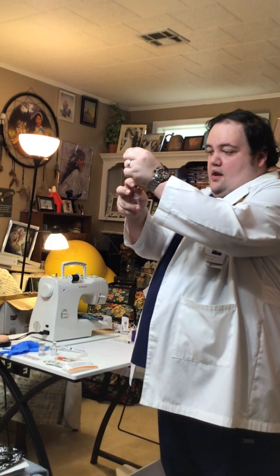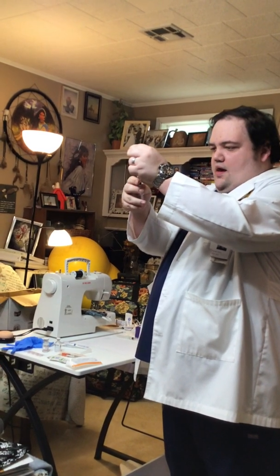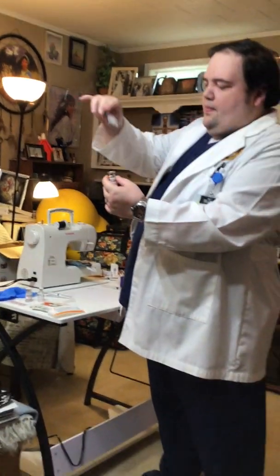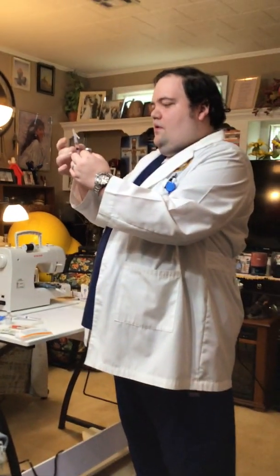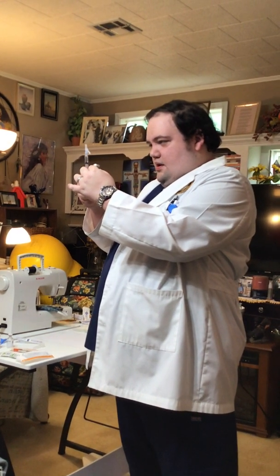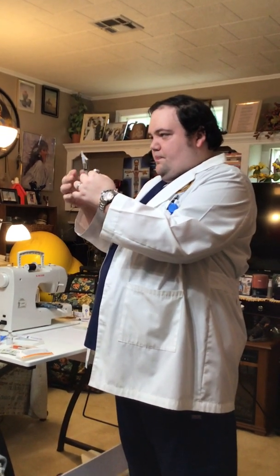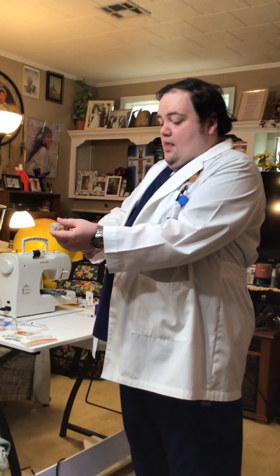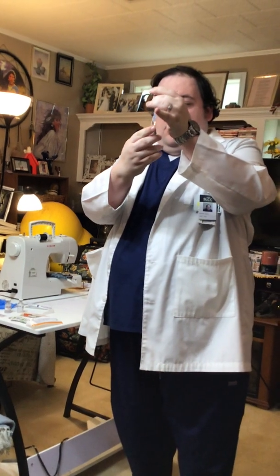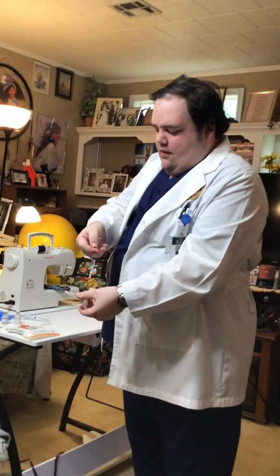I'm going to aspirate 1.5. I see there's a little air pocket in there. So knock the air pocket out. It's not a complete dose. Once again, without touching the stopper, I'm going to aspirate a full 1.5. All right?